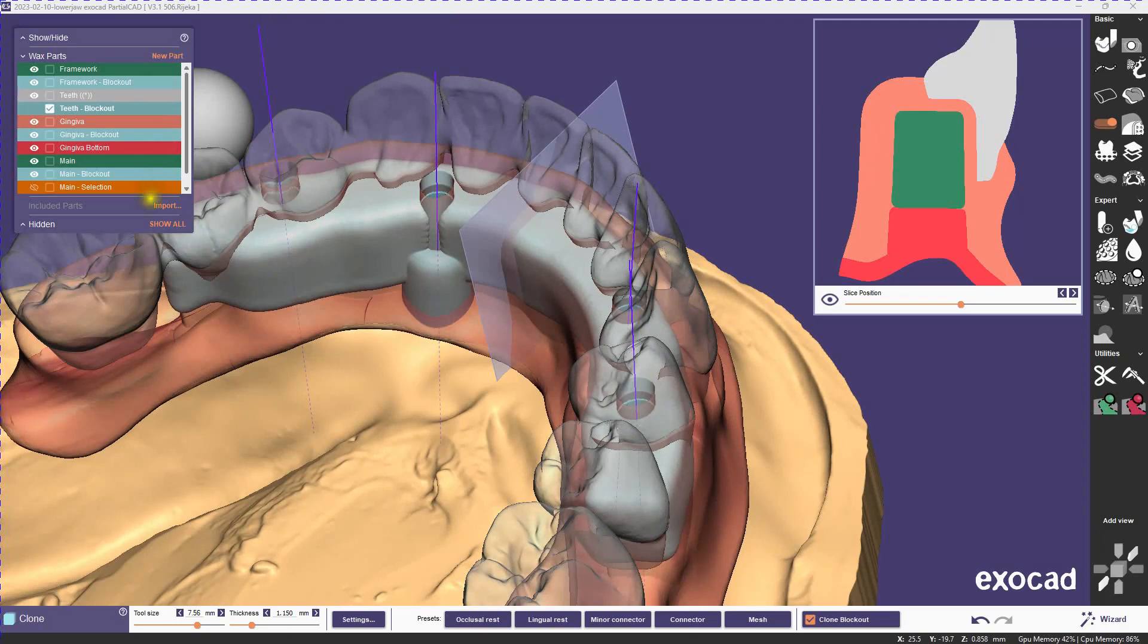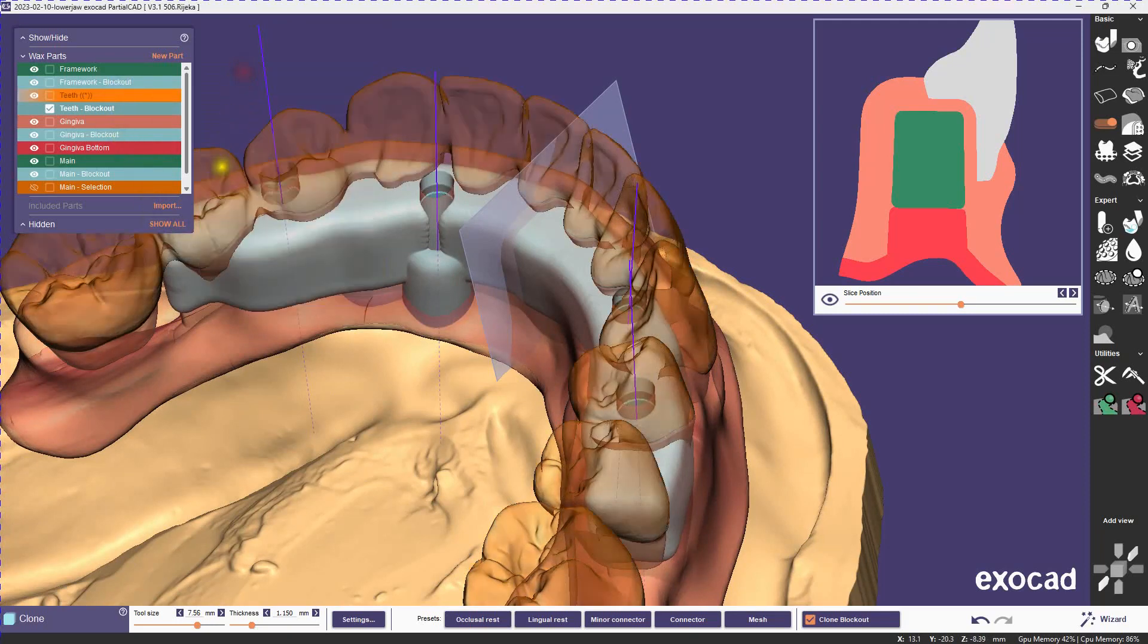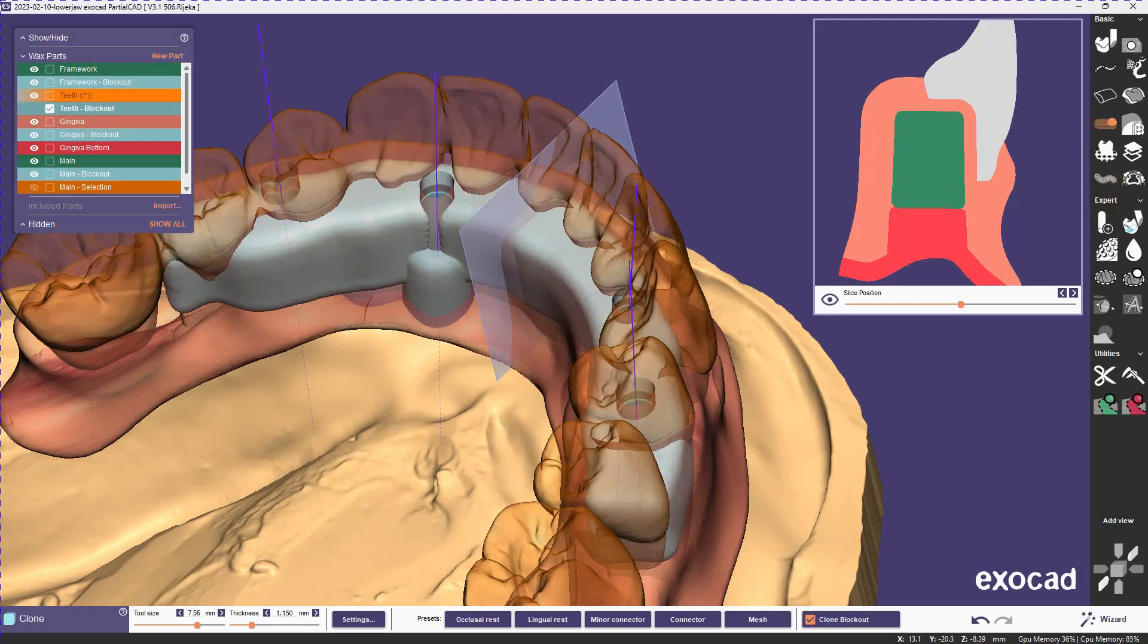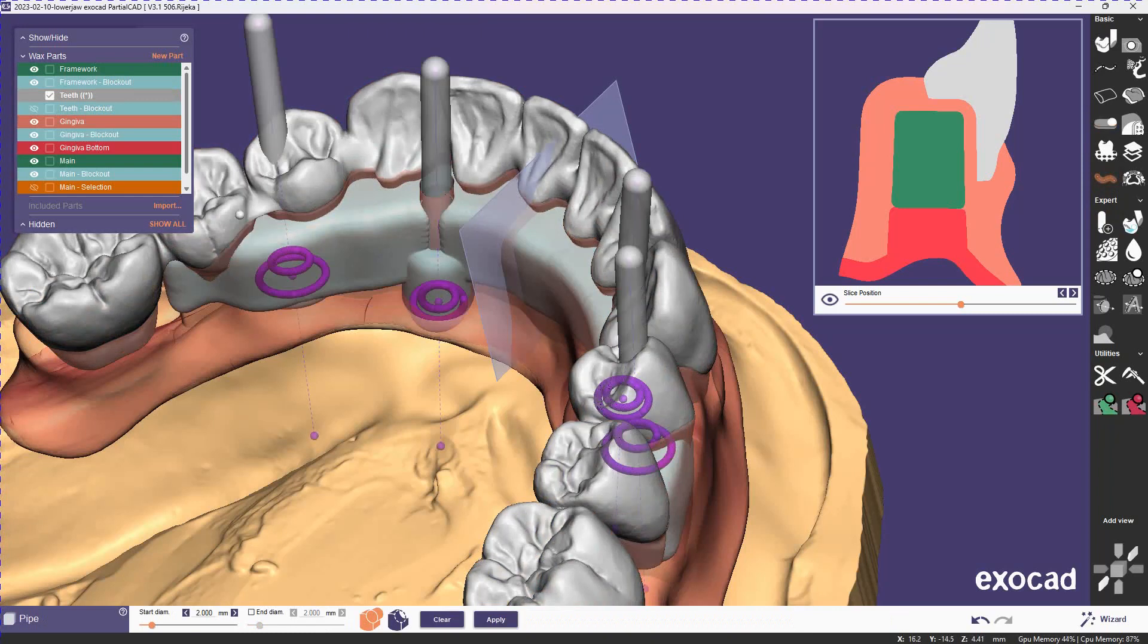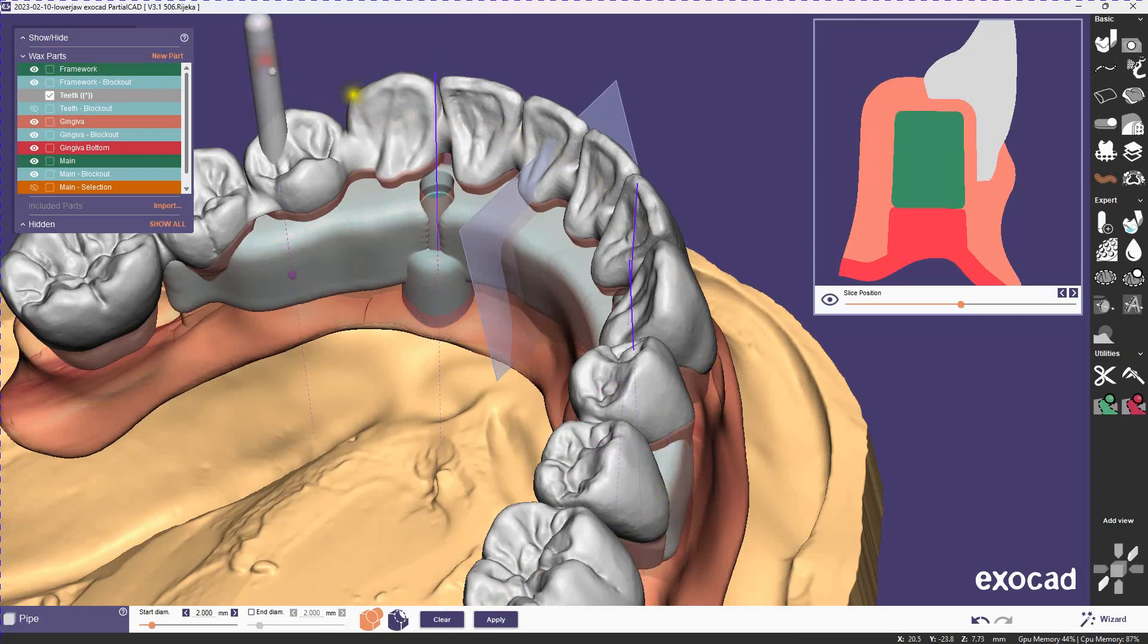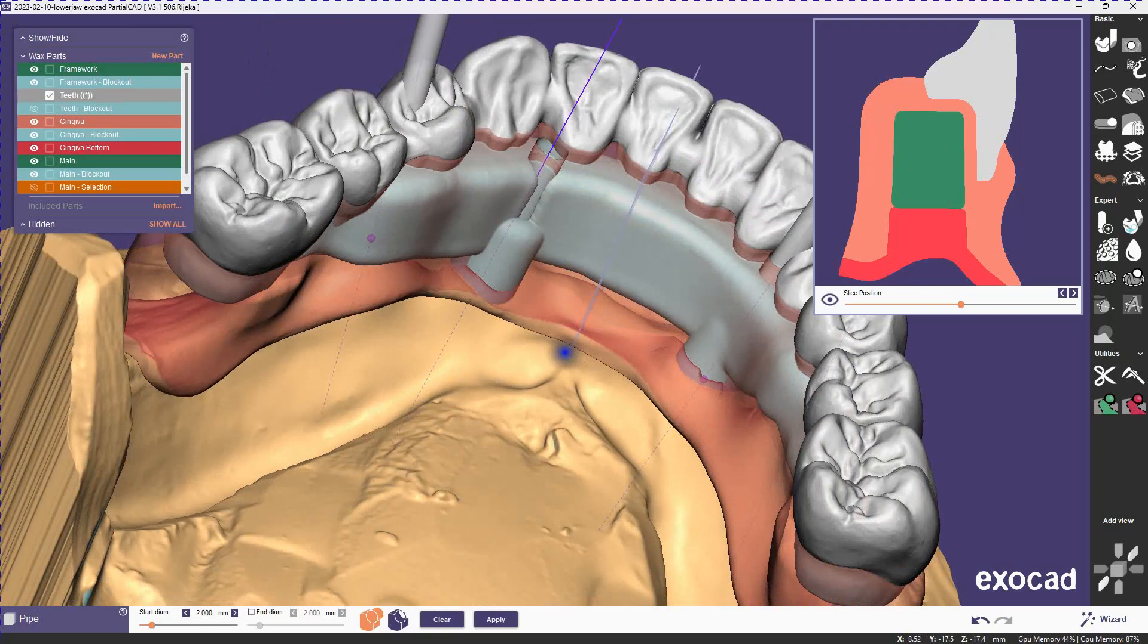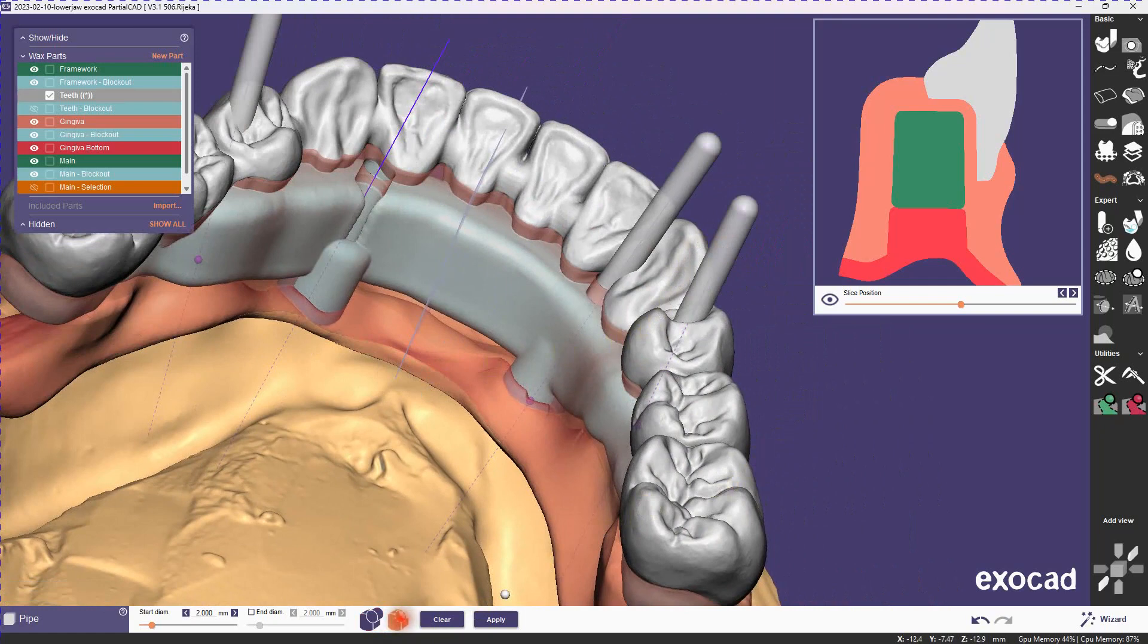So the remaining thing to do now with the teeth is just to remove the screw channel, so we'll make the teeth volume active, and we'll just select the screw channels, and we'll do a subtractive pipe. Pipes can be additive or subtractive. We'll just select the ones that we need here. That's the subtractive mode there, and we hit apply.